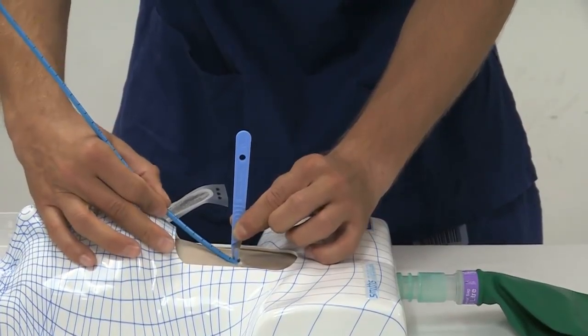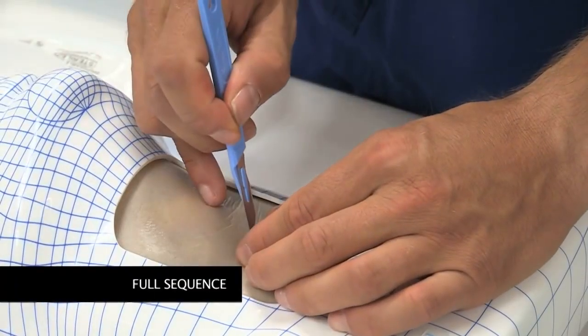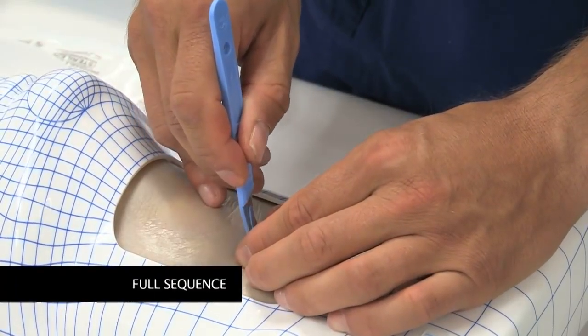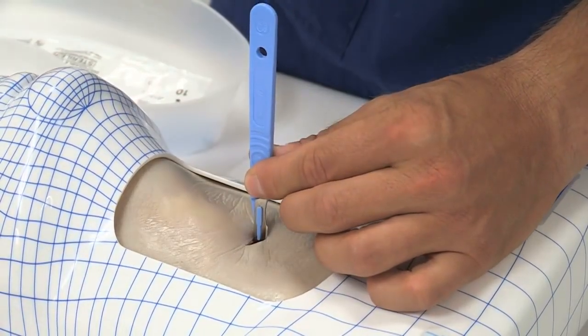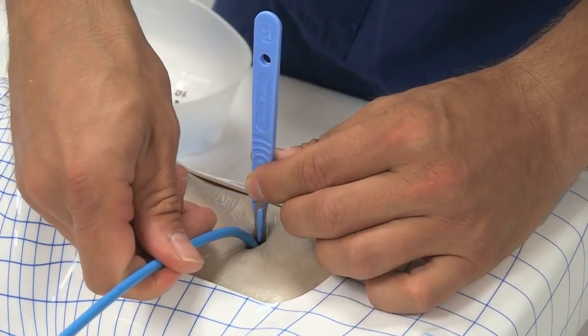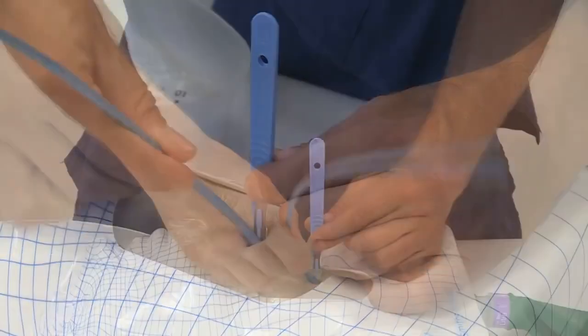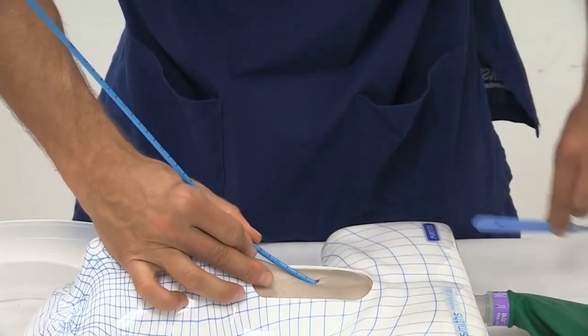Advancing the bougie into the airway should be a smooth procedure requiring not more than 2 fingers and gentle pressure. While advancing the bougie, tracheal rings can often be felt. If tracheal rings are not identified, it may be necessary to feel for hold-up of the bougie to exclude gastric or pretracheal insertion. This should again be performed with gentle 2-finger pressure only.